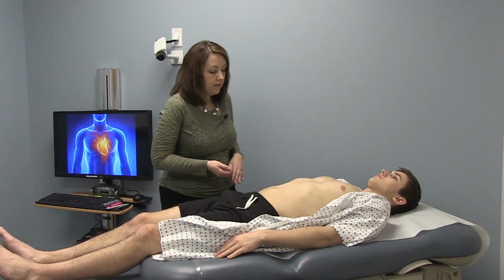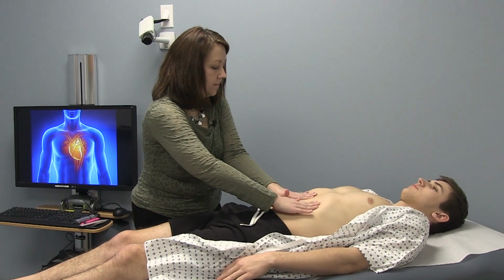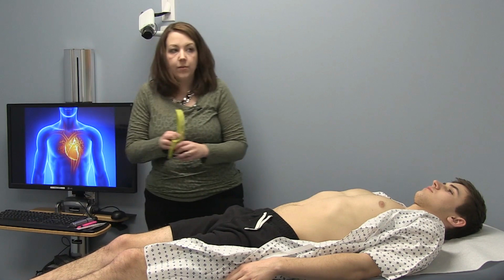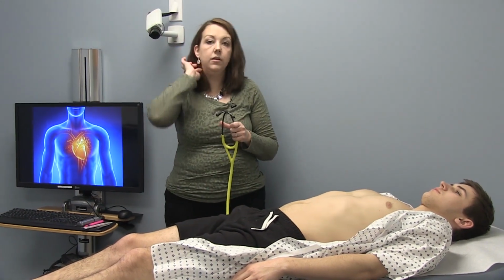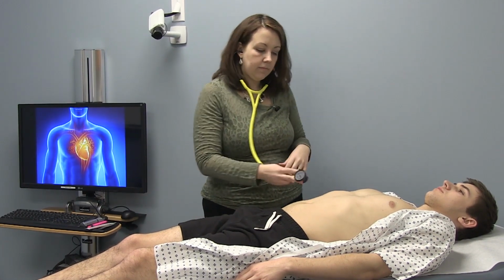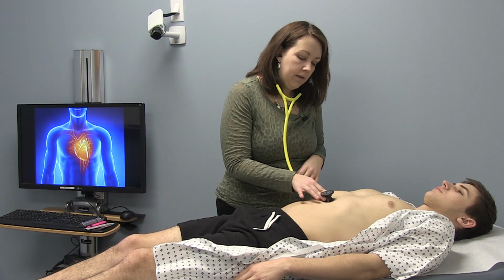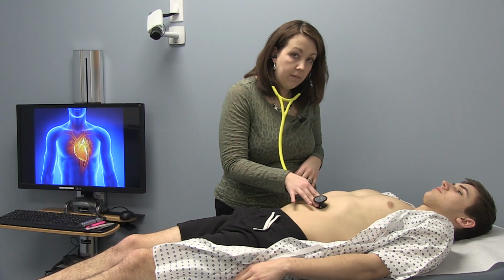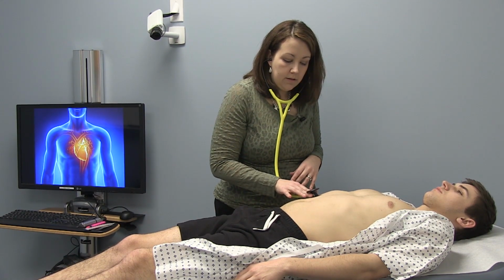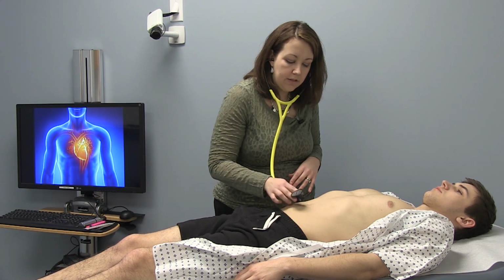I'm going to palpate the aorta just to make sure it's not enlarged. And then we're going to go back and auscultate. The regions that we're going to be auscultating are the aorta, the renal arteries, and the iliac arteries. So we'll listen for any bruit at the aorta. The renal are above the belly button on either side. The iliac are just below the belly button on either side.